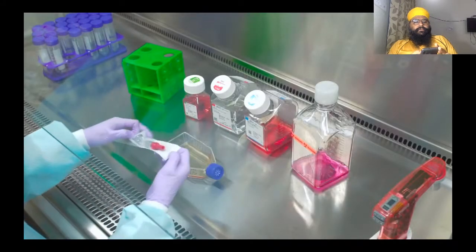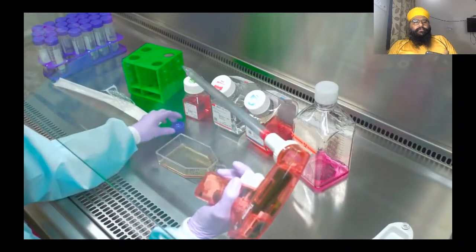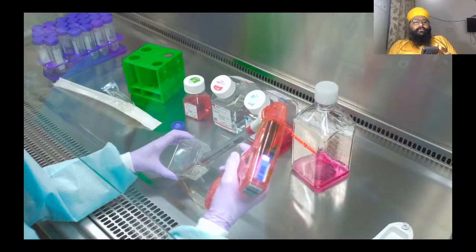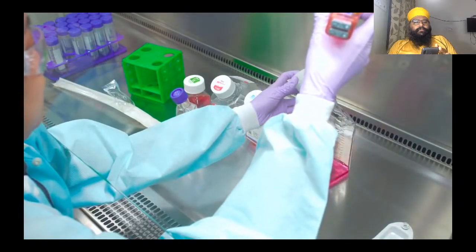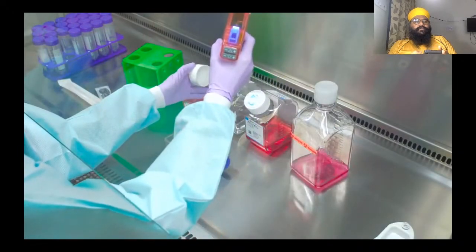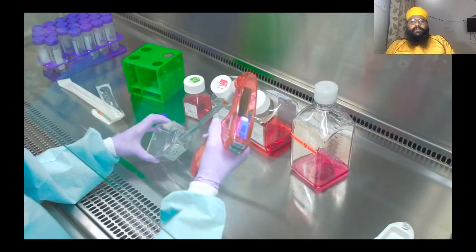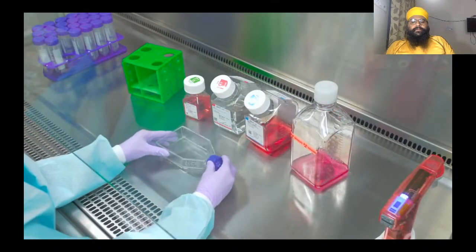For adherent cells, remove the spent medium from the flask using a sterile pipette. Rinse the cells with a balanced salt solution, such as DPBS. Make sure to use a salt solution without calcium and magnesium, as these may inhibit your cell dissociation reagent.